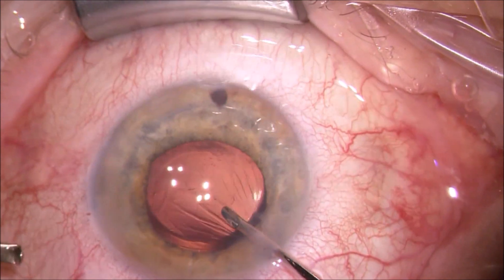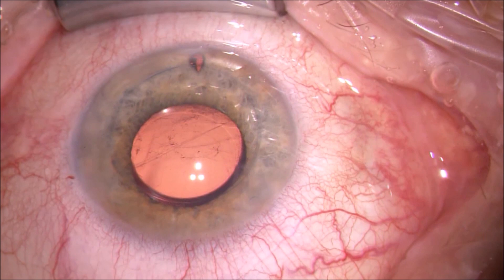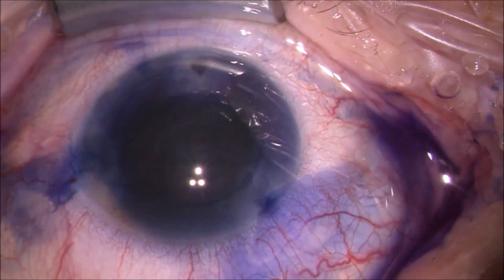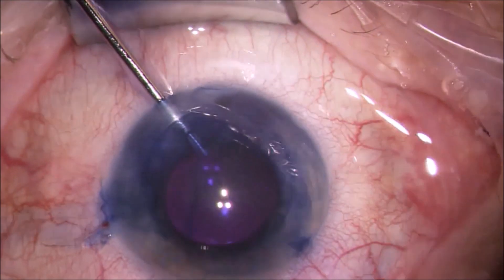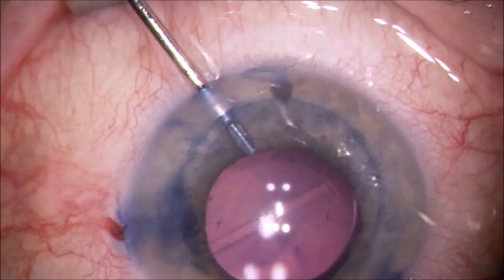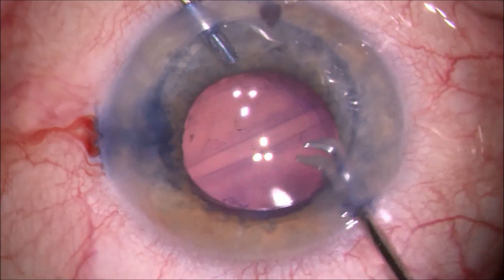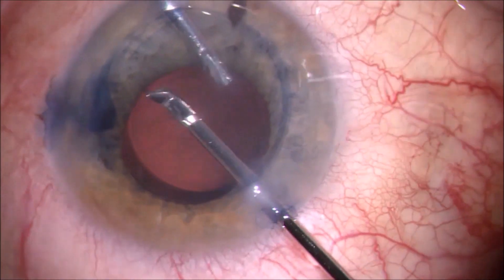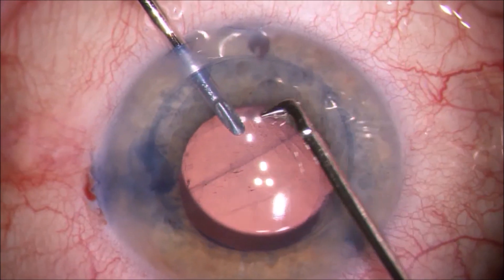As you can see, there are some remnants left. Therefore, I restain with trypan blue inside the eye, trying to make the remnants more visible in order to pick them out with my inverted forceps. This is sometimes the problem when using a dispersive viscoelastic — the staining characteristics might not be optimal. I was experimenting with leaving it away, but I'm just so used to cohesive and dispersive viscoelastics during cataract surgery that I've not given up this practice. I don't think it's that much of a big deal.